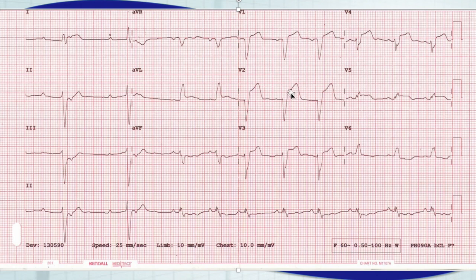So if you look here, this is almost half of the size of this. Look how much ST segment elevation you have there. We said it's about 5 or 6 millimeters, and this S wave is maybe 10, maybe 11 millimeters. So we're at about half or 50%. So we definitely reached that 25% rule. That's indicative of an MI. Now, if you go here to V3, and let's say you had 4 millimeters of ST segment elevation here, and this S wave was maybe 10, maybe 12 millimeters. Well, 4 millimeters is a third. So it's more than 25% of that preceding S wave.